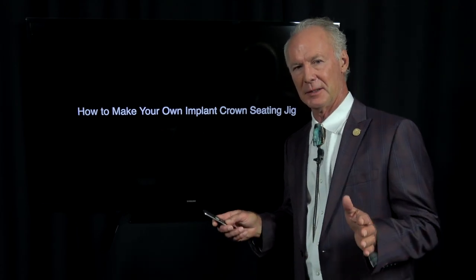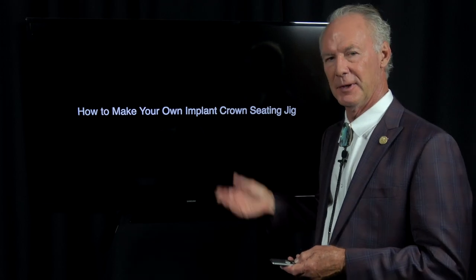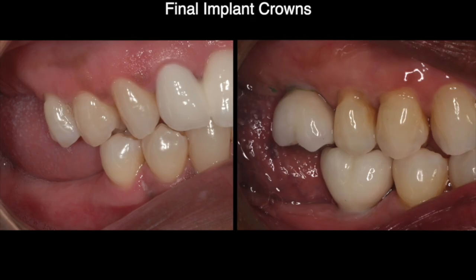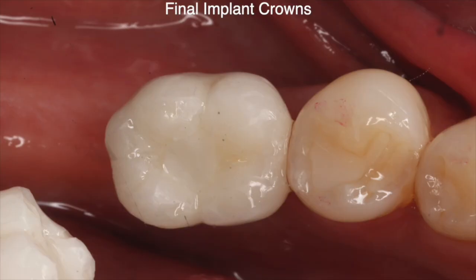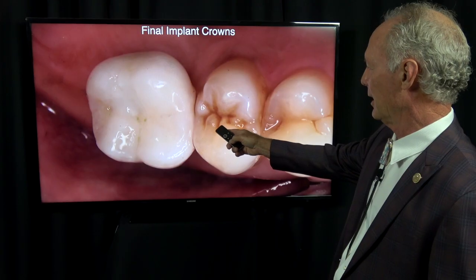Hello. If you place implants, especially if you place implant abutments and crowns, this could be very helpful for you. One of the keys with placement of implant abutments and crowns is to orient them correctly on the implant. This is how to make your own seating jig if the laboratory has not fabricated a Duraline seating jig for you. This is before and after — we're placing three implants with implant crowns and abutments.